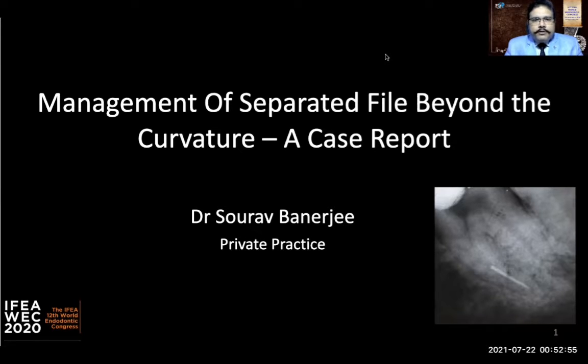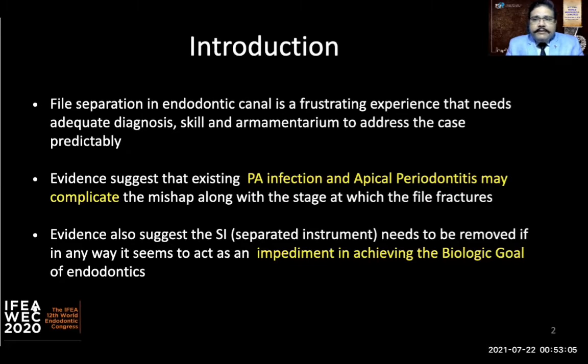I'm privileged to have this opportunity here today to present at the eminent platform of IFEA 2021. Management of separated file beyond the curvature, a case report. When we have a separated file in the endodontic root canal, it is obviously a frustrating experience. It needs adequate skill, armamentarium, and diagnostic aids to address the case.